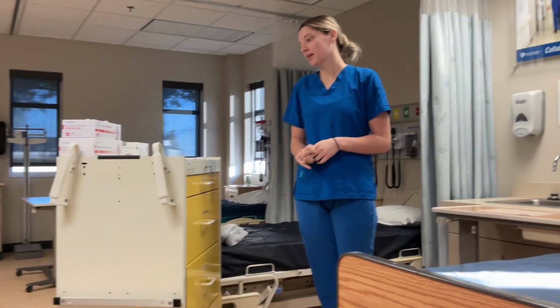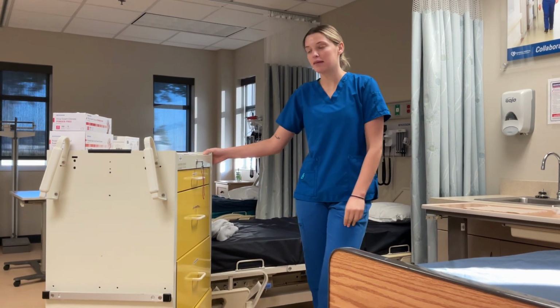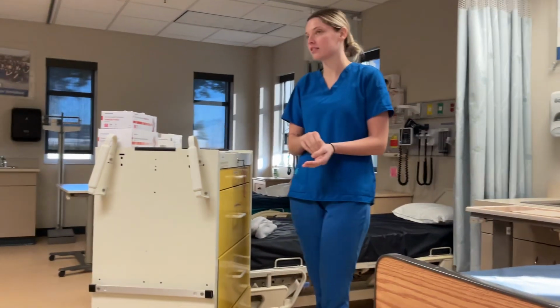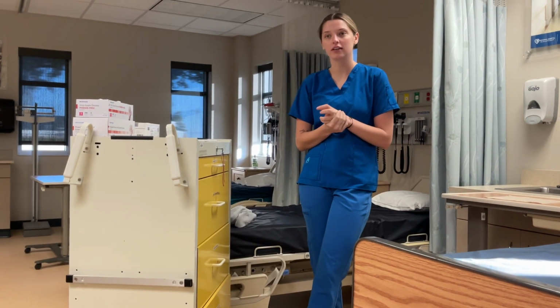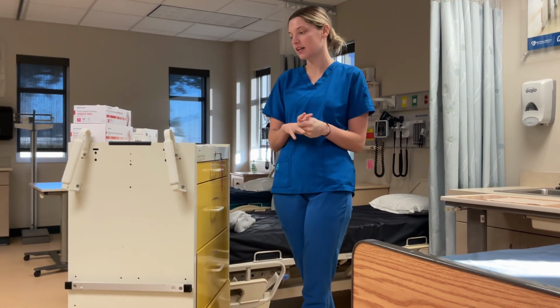So today I am given ketorolac to give to my patient. With that medication, I would make sure that I'm checking the kidney values, so the BUN and creatinine. I check those beforehand and they are at the normal level, so I'm able to give ketorolac today.